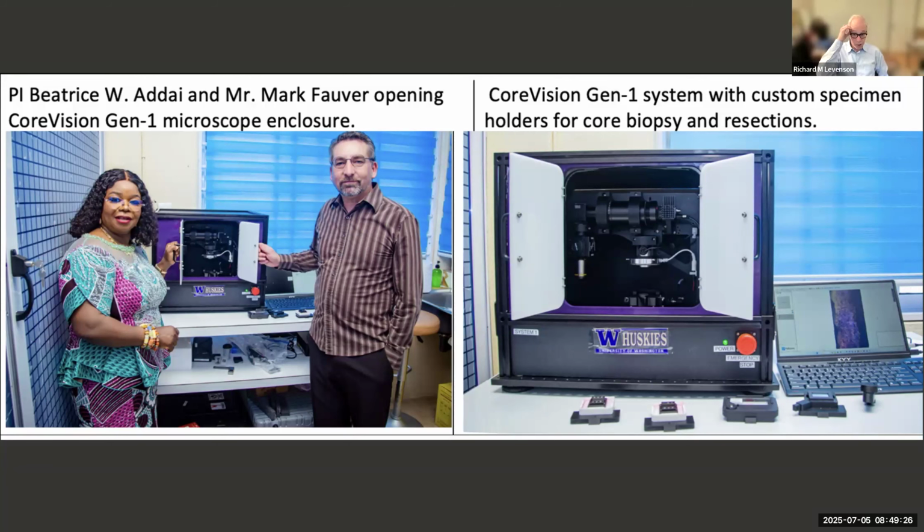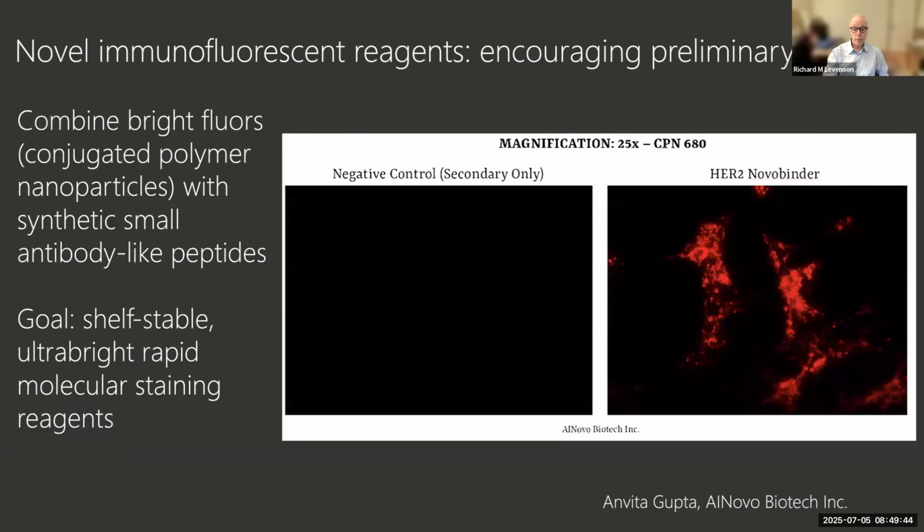He's about to ship generation 2, which has a 20x instead of a 10x lens and less vibration. And so I think we're just about to start to acquire clinical grade quality images for patient evaluation, and ultimately patient care in Ghana and hopefully around the world.